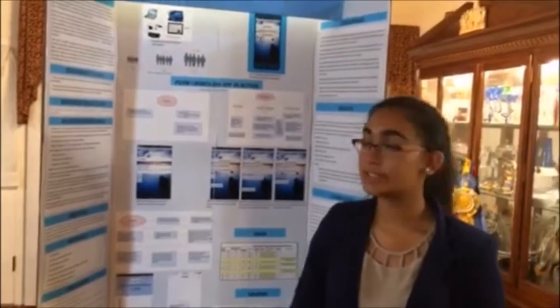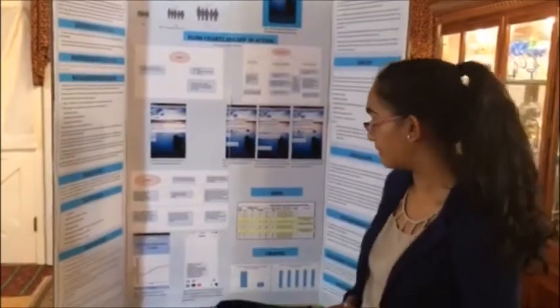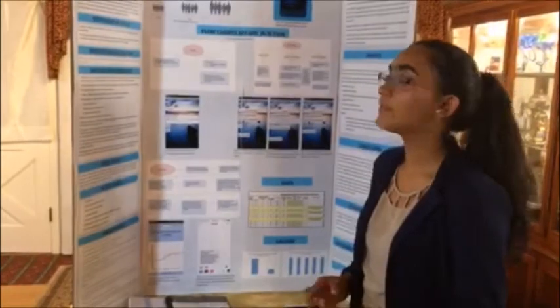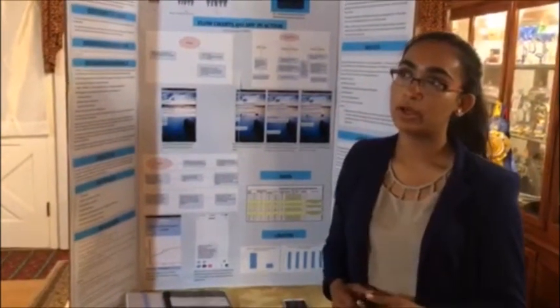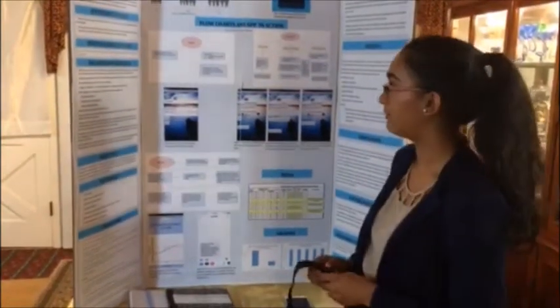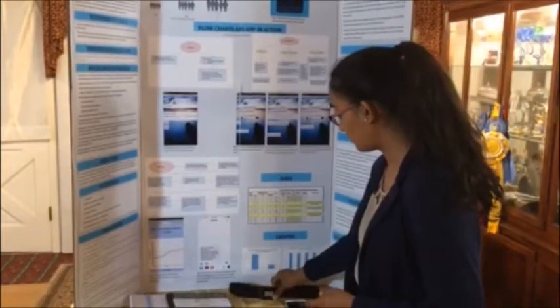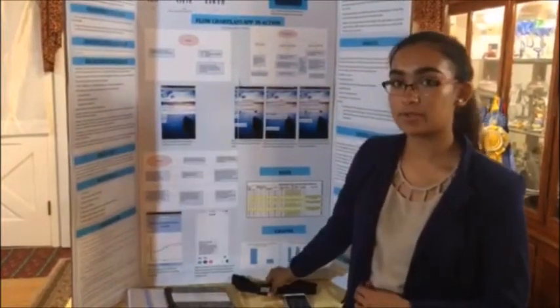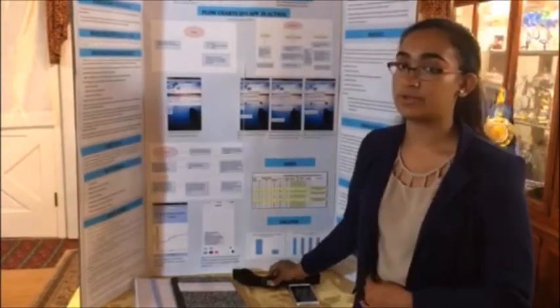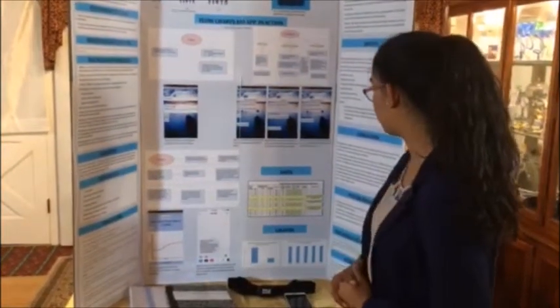In the future, I would like to take my device further in a variety of different ways. Number one, I would like to implement galvanic skin response into the sensor, which is basically how much you sweat. And this would provide another biometric to support and really confirm that you are going into an autistic episode. Secondly, I would like to take this device to the App Store, as MIT App Inventor, which I coded this on, is only available on Android devices. And to do this, I might have to convert the code, but I really would like to do this.